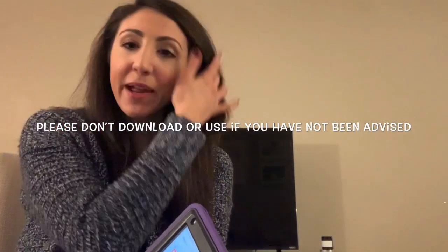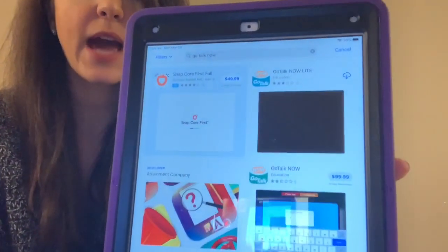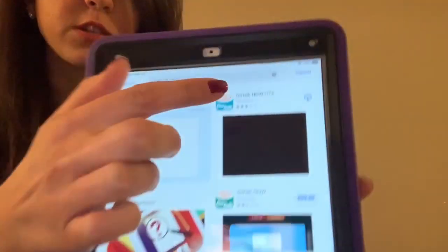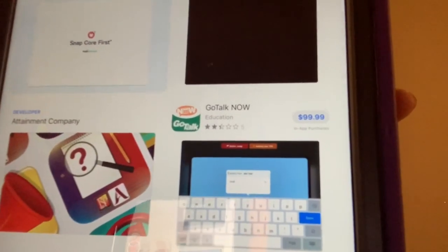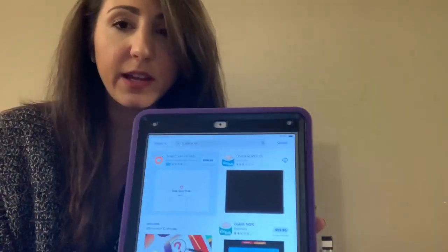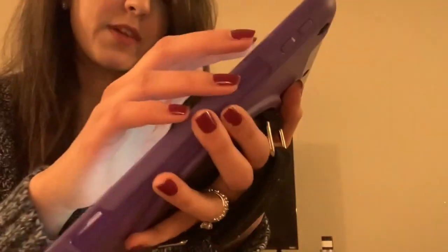I know that if you're a parent of one of my students, I may have advised you to come view this video so that you can download this app at home. I'm going to walk you through those steps right now. So first we're going to go into the App Store. I have my iPad, and over here you'll see that there's a GoTalkNow Lite. There's also the regular form of GoTalk, and that's, as you can see, expensive, but we don't need that. The GoTalkNow Lite app is actually very great, and there's not much that it's missing for the basic communication needs. So let's go ahead and download that. It's for free.